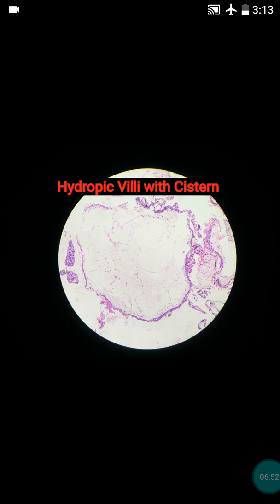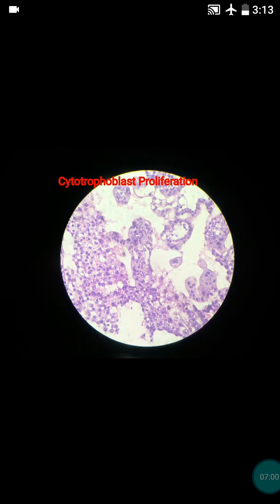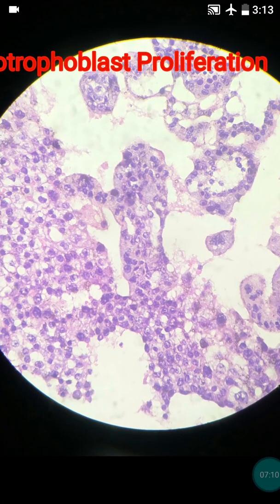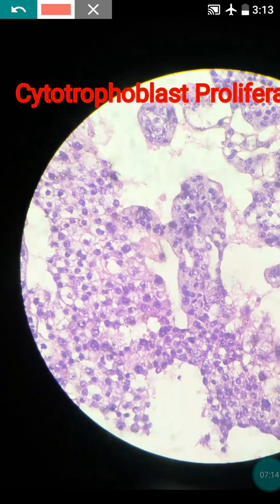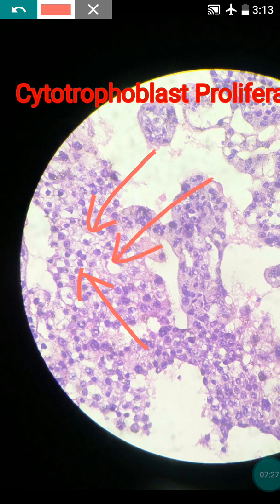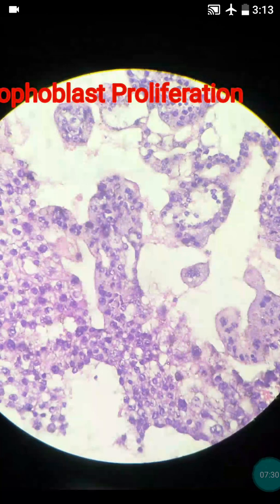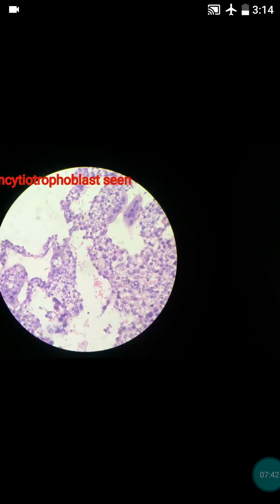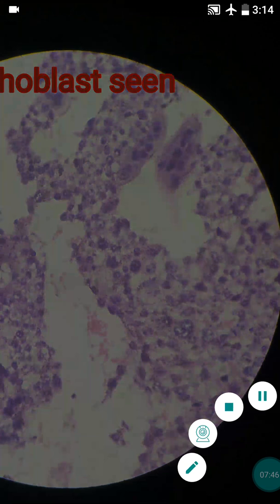In advanced complete mole, there is presence of cytotrophoblastic cells all around the villi, but here it was not, because this was an early complete hydatidiform mole. You can again see the hydropic villi with cisterns. There will be markedly increased cytotrophoblast in the complete mole. You can see these cells — they are all cytotrophoblast having clear cytoplasm and centrally placed nucleus.